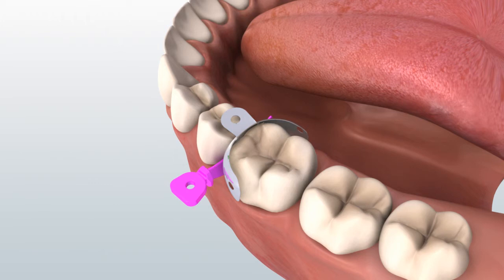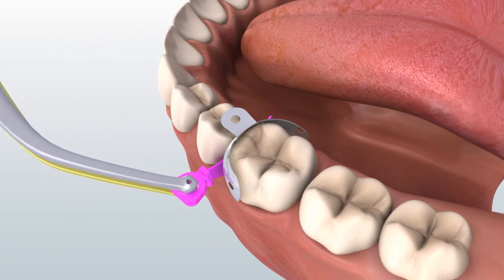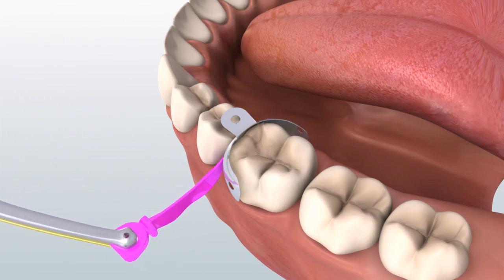The probe can also be used to peel away the matrix from the composite just below the contact point to break the bond between the matrix and the composite. This will make matrix removal simple, even with a tight contact. Remove the wedge with the pin tweezers.